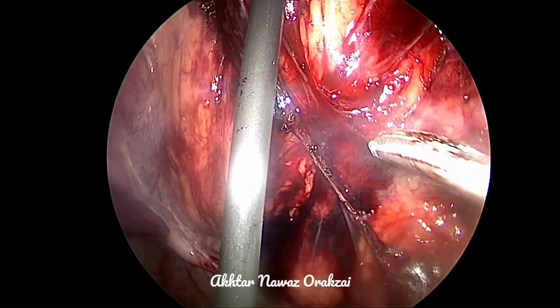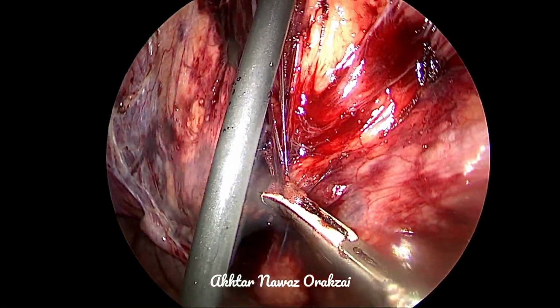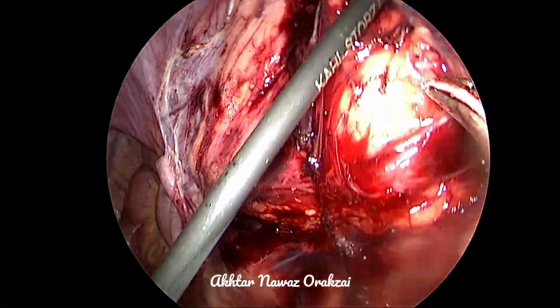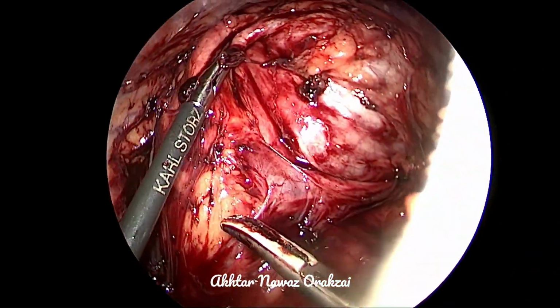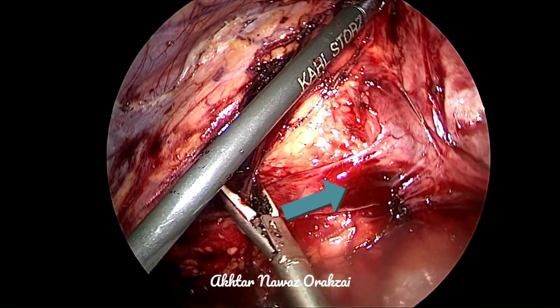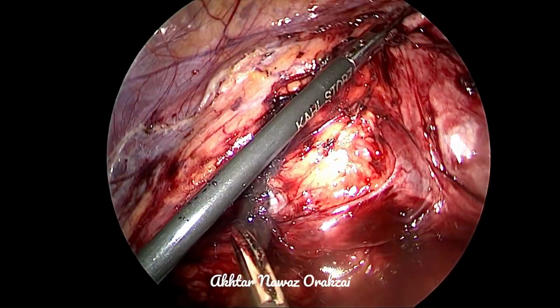So we found that the pathology here was the so-called aberrant vessel, although they are not aberrant. Just the anatomical location is abnormal. You can see that there is a vein and there is a pulsating artery.